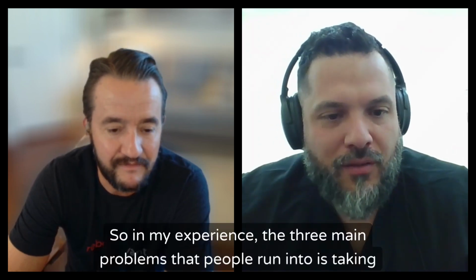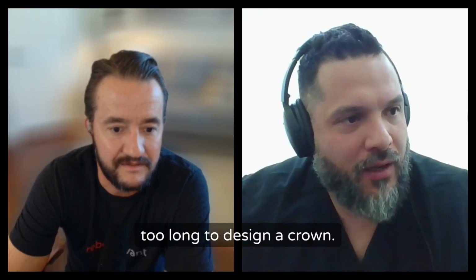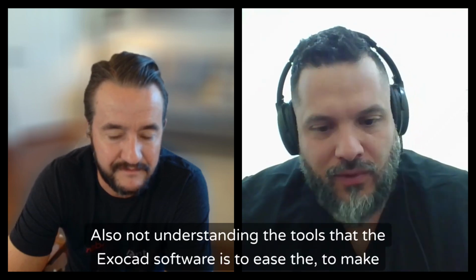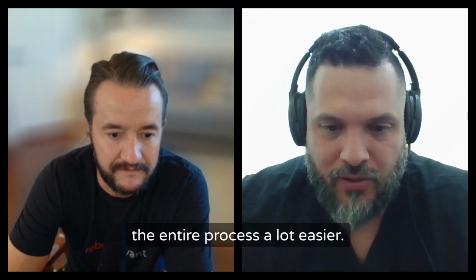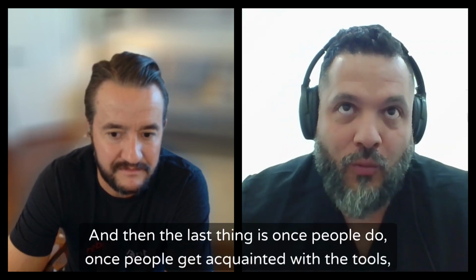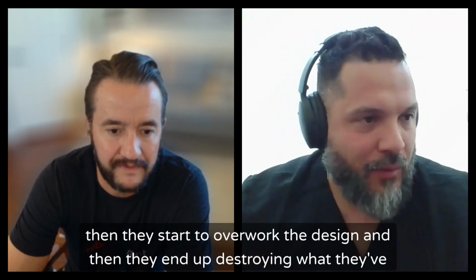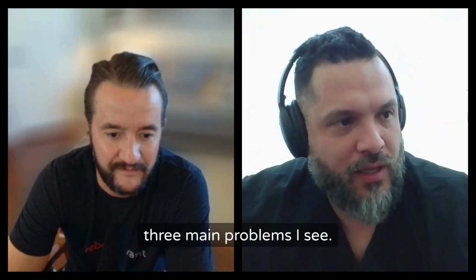So, in my experience, the three main problems that people run into is taking too long to design a crown. We're going to focus on single crowns right now. Also, not understanding the tools of the exocad software to make the entire process a lot easier. And then the last thing is, once people get acquainted with the tools, then they start to overwork the design, and then they end up destroying what they've already built. So those are the three main problems I see.